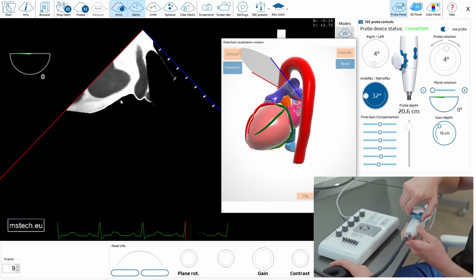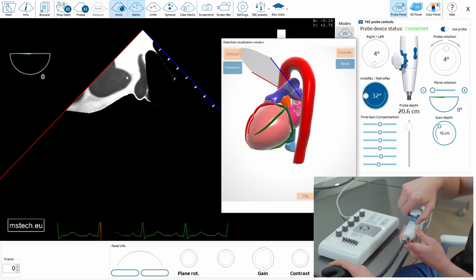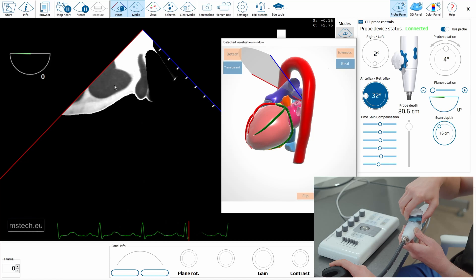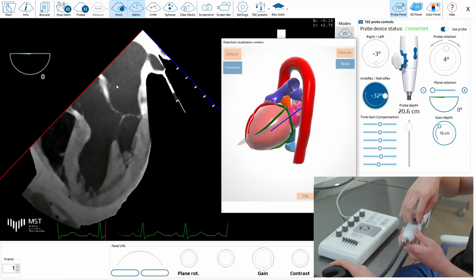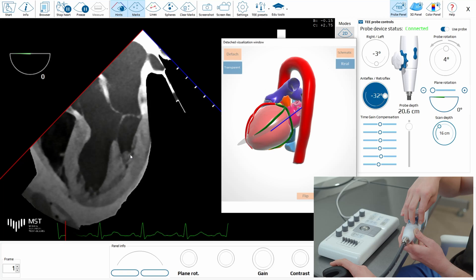You see we are going to structures which are located very high, like big vessels. If you go retroflexion, you go to the left ventricle, even to the apex of the left ventricle.